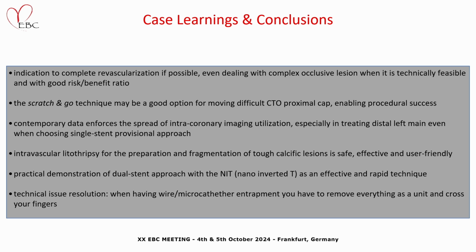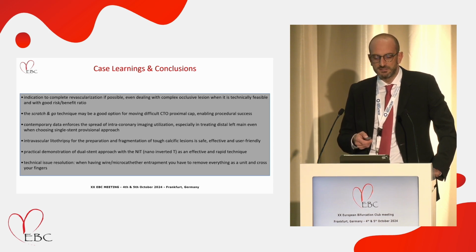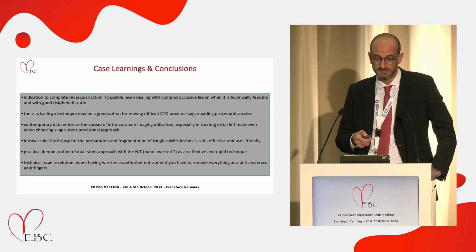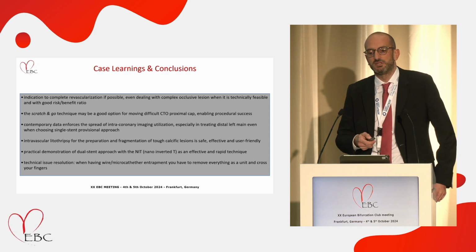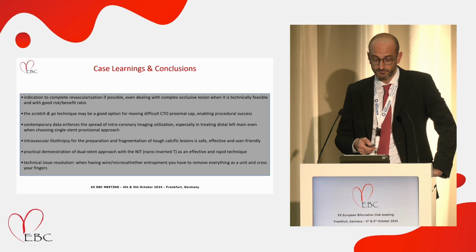Here we use a CTO technique that is called scratch and go, and is a good way to modify the proximal cap of tough CTO like this. In this case it was effective. Contemporary data and the latest CCS guidelines highlight the need to use intracoronary imaging, especially in treating a subset like the left main.